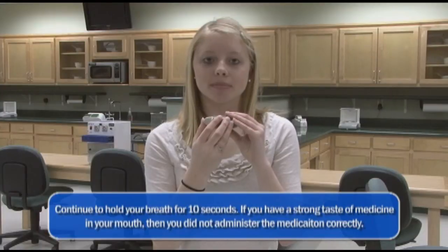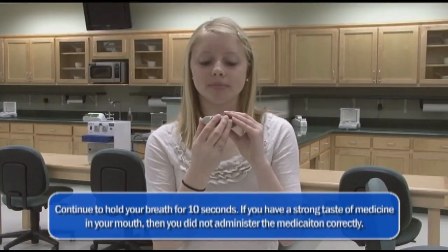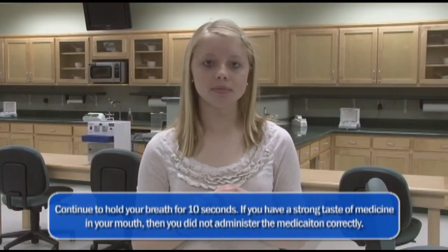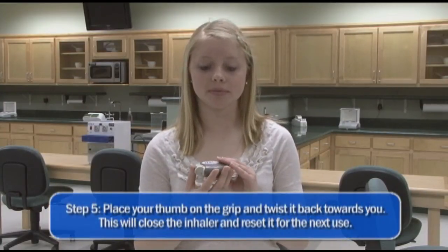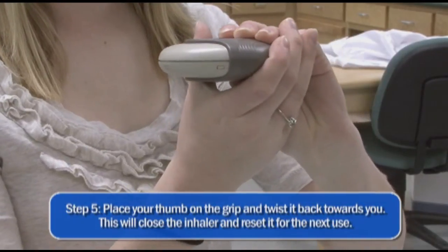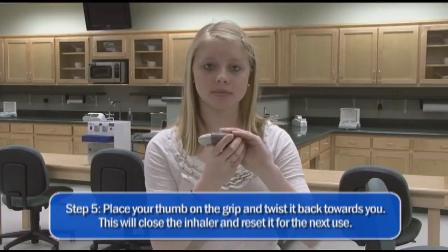Continue to hold your breath for 10 seconds. If you have a strong taste of medication in your mouth, then you did not administer the medication correctly. Now place your thumb on the grip and twist it back towards you. This will close the inhaler and reset it for the next use.